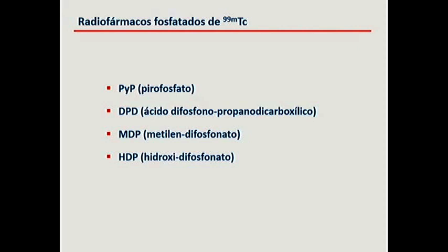In our countries, the most popular one would be MDP. I don't know if in Colombia it's widely used. MDP is the radiopharmaceutical of choice for bone imaging. DPD is widely used in Europe, and HDP is widely used also.